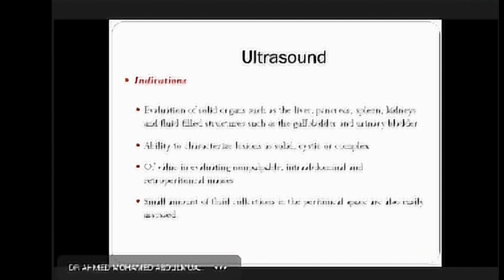Okay, now we come to the ultrasound. Ultrasound is a very good tool for some indications, because there is no radiation dose to the patients, and it is one of the safest. It is the safest modality to start with. And if I can reach my diagnosis by doing ultrasound, then ultrasound is the initial investigation tool for me.